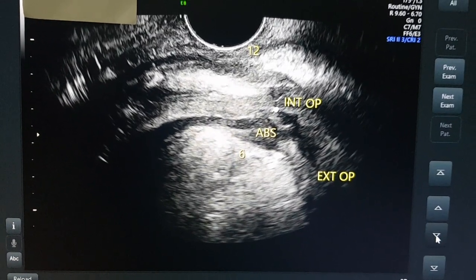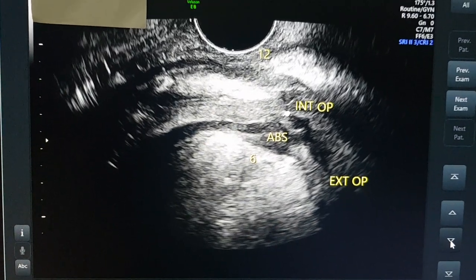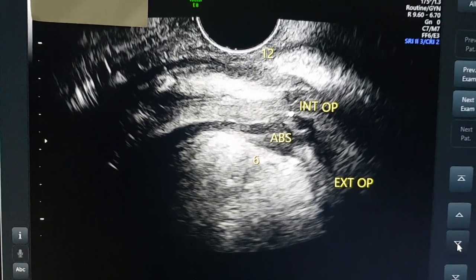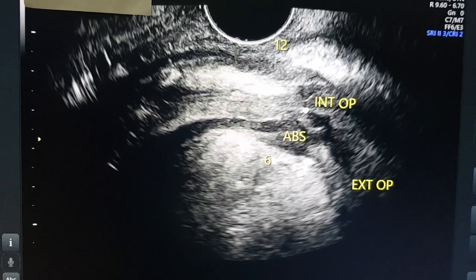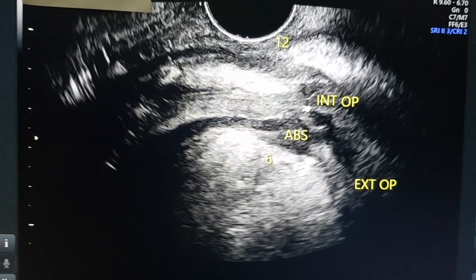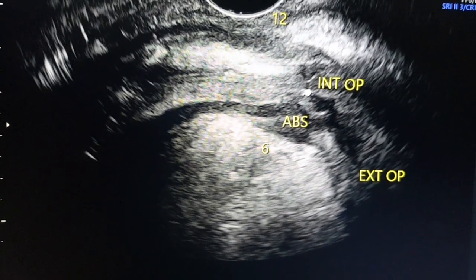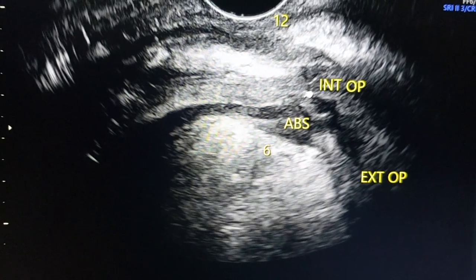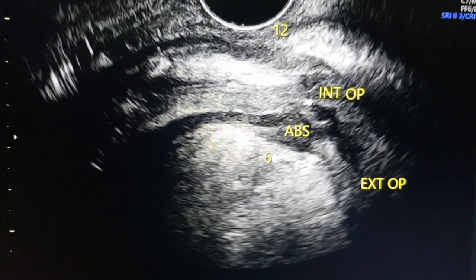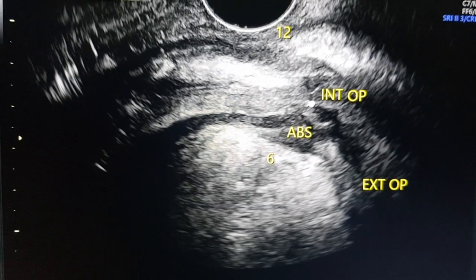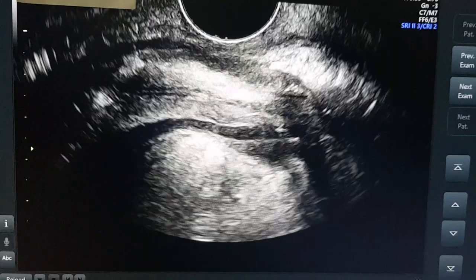Now I rotate the endocavitary probe in a sagittal plane. You can see 12 o'clock is anterior and 6 o'clock is posterior. The external opening, intersphincteric abscess, and internal opening have all been labeled. In this sagittal plane view, the external opening forms a track along the subcutaneous plane, goes into the 6 o'clock position, enters the intersphincteric plane, forms an abscess, and enters the anal canal through the internal opening.